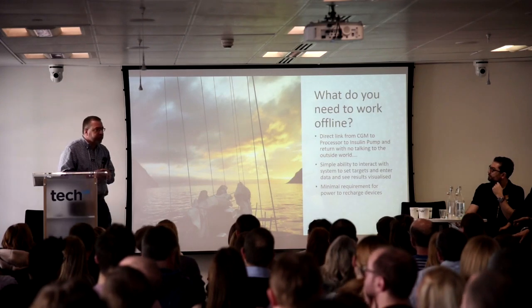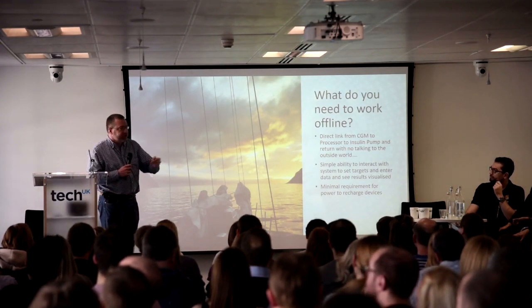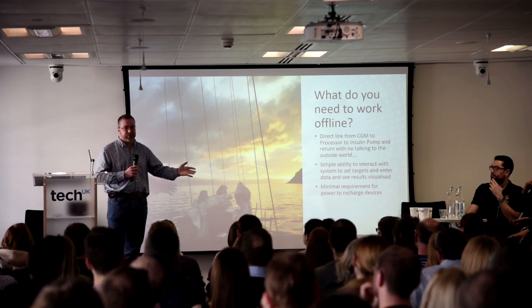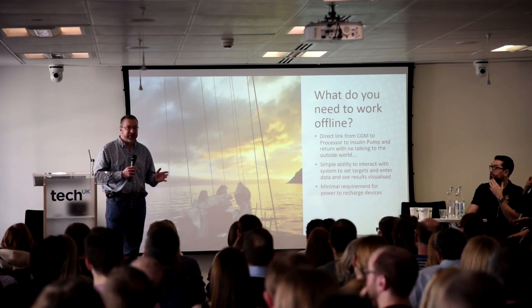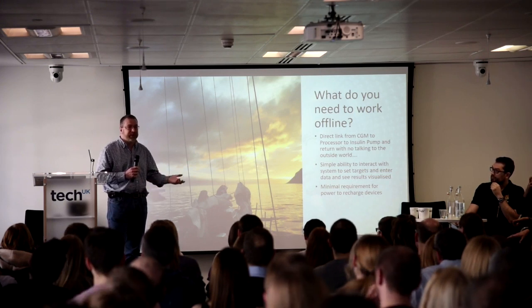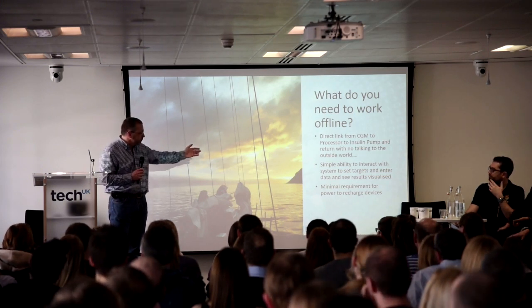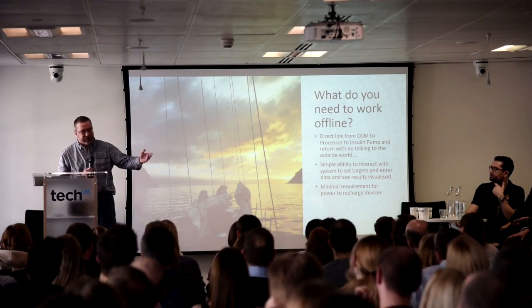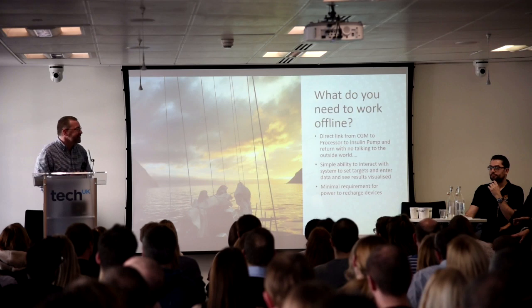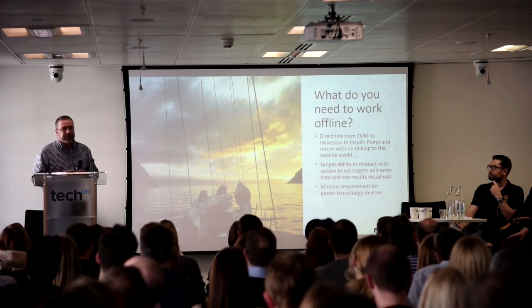So what do you need to work offline? Well, the picture that Dana puts up was quite simple. It showed a CGM, it showed a computer, it showed a pump. You need to have the ability to have all those things talk to each other completely independently of internet. Not talking to the outside world. So whilst Kev's talked about Nightscout, that's great, but it only gets the figures when I come back into somewhere I have internet and the ability to use it. But that brings its own challenges.